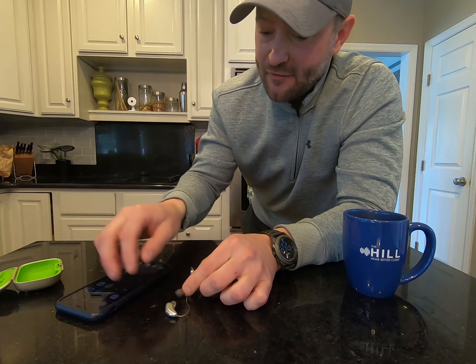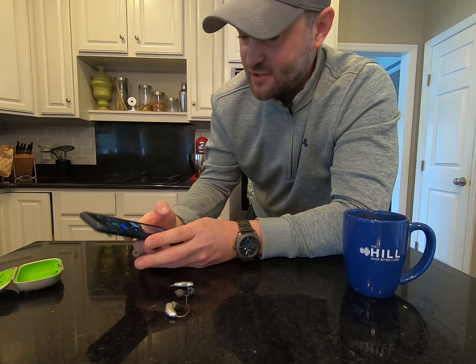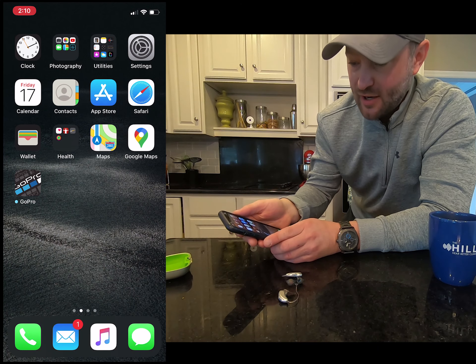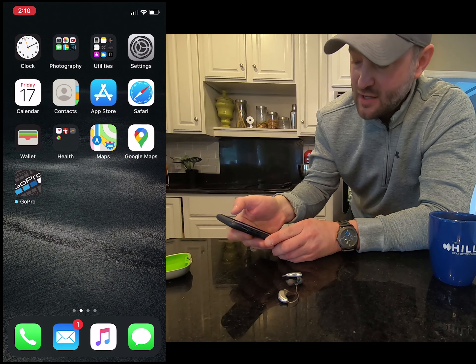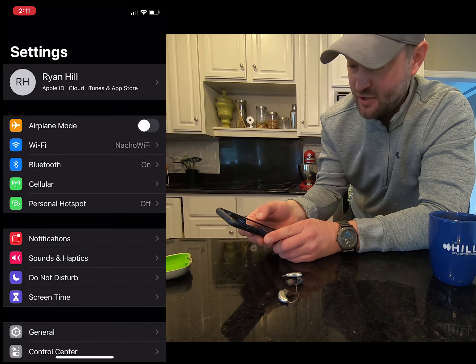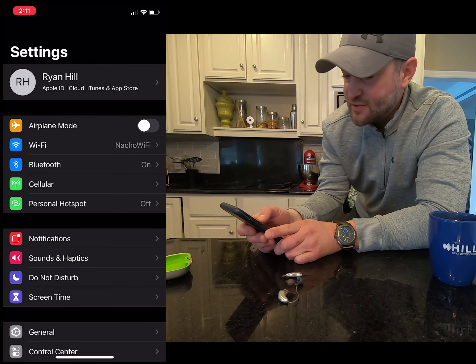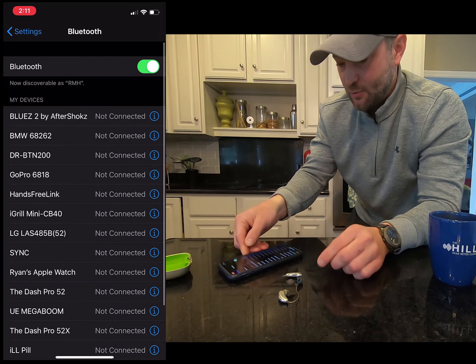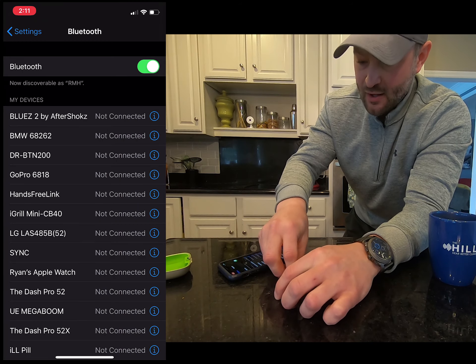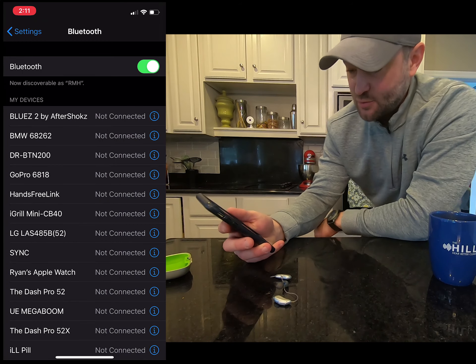I have my hearing aids here — you do want to make sure they're turned off before we do this. I'm going to share my screen and find my settings. I'm going to go up to my settings app and then straight to Bluetooth. With some other hearing aids you use the accessibility menu, but we don't have to with the Phonaks because they use traditional Bluetooth.